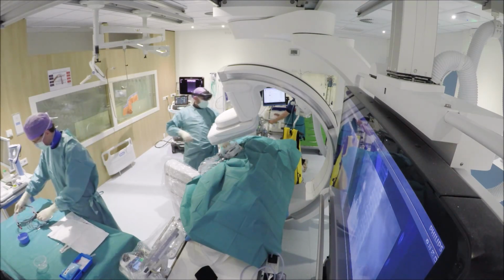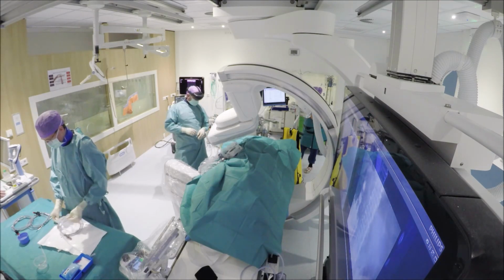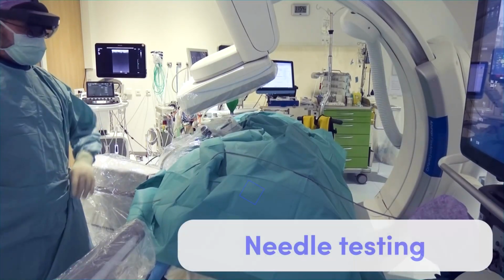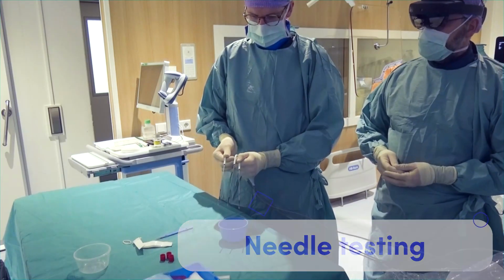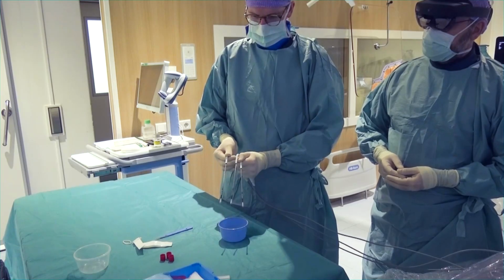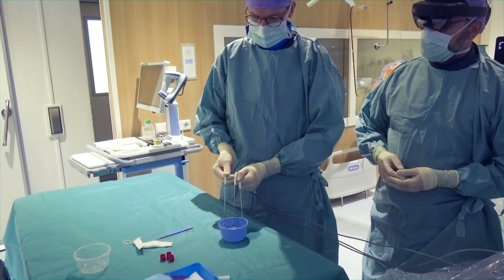For this procedure we decided on using 3 ice pearl needles, which are now being unpacked and then connected to the visual ice machine that controls the freezing process. In the testing phase, the needles are being tested by a short test cycle where we first warm up the needles and then do a short test freeze to make sure that there's no leakage of gas and that the needles are functioning properly.